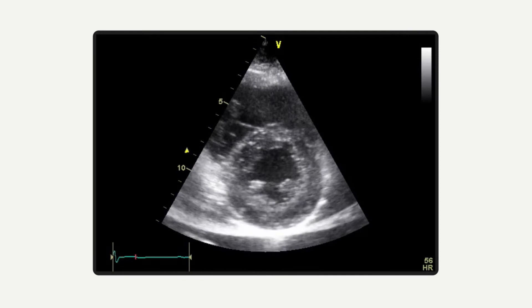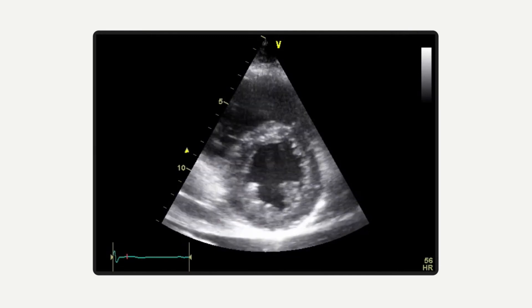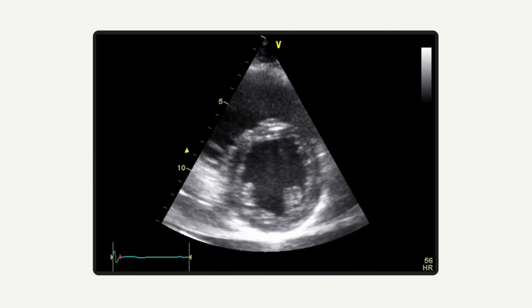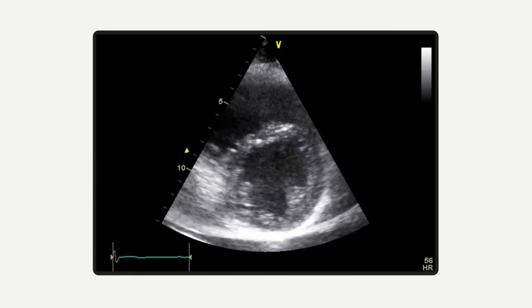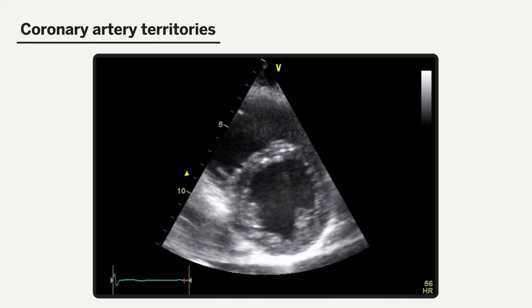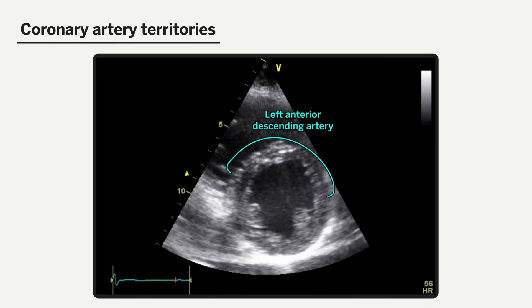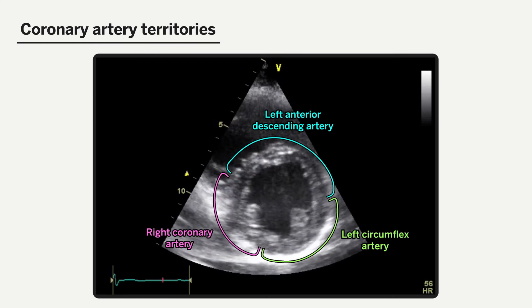More advanced analysis involves examining the ventricle for wall motion abnormalities to localize an infarct if one is present. In this view, we can assess territories supplied by the LAD, RCA, and left circumflex coronary arteries.